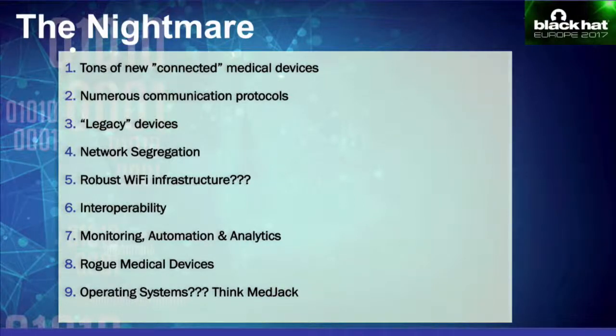Segregation of data could be a big problem because we've already established that there is a lot of malware and ransomware trying to target medical devices because of some of the issues in there. So keeping these devices on the same network as your hospital billing system could be a problem as well.